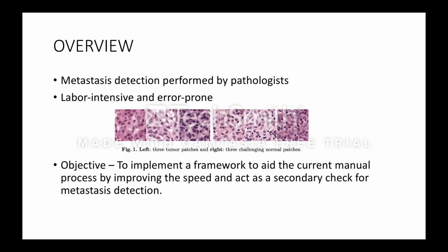To give you an overview of the problem, metastasis detection is typically performed by pathologists by going through hundreds, thousands of slide images from the lab.